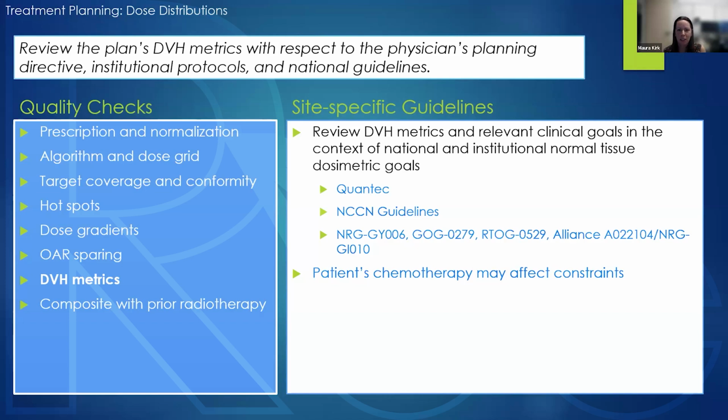For our DVH metrics, you're looking to review the DVH metrics and relevant clinical goals in the context of national and institutional normal tissue dosimetric goals.